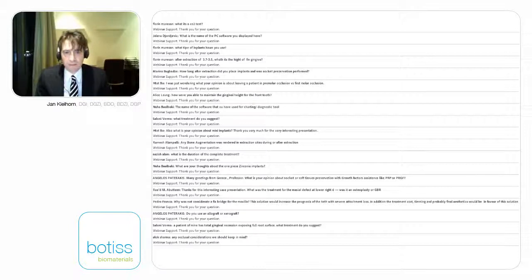Ilya Golikov, you want to ask what is more preferable in vertical augmentation, allogenic or autogenic? We have to say that if you use autogenous bone for vertical augmentation, of course, you can go a bit higher. That's what we've seen using rings, for example. But the bone is limited. It also works with allografts very nicely, but of course not to the same height as autogenic, though with the same results.